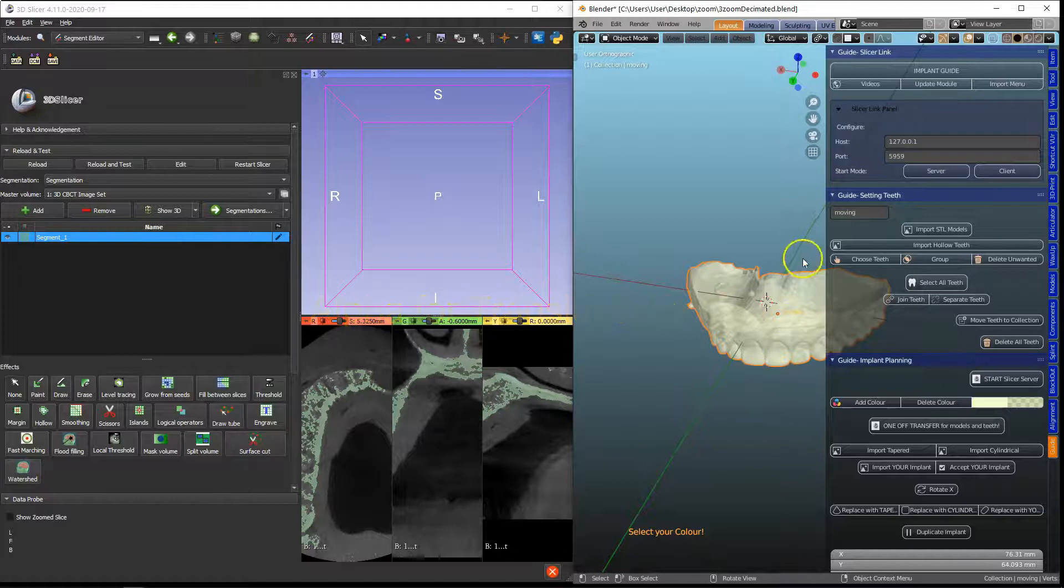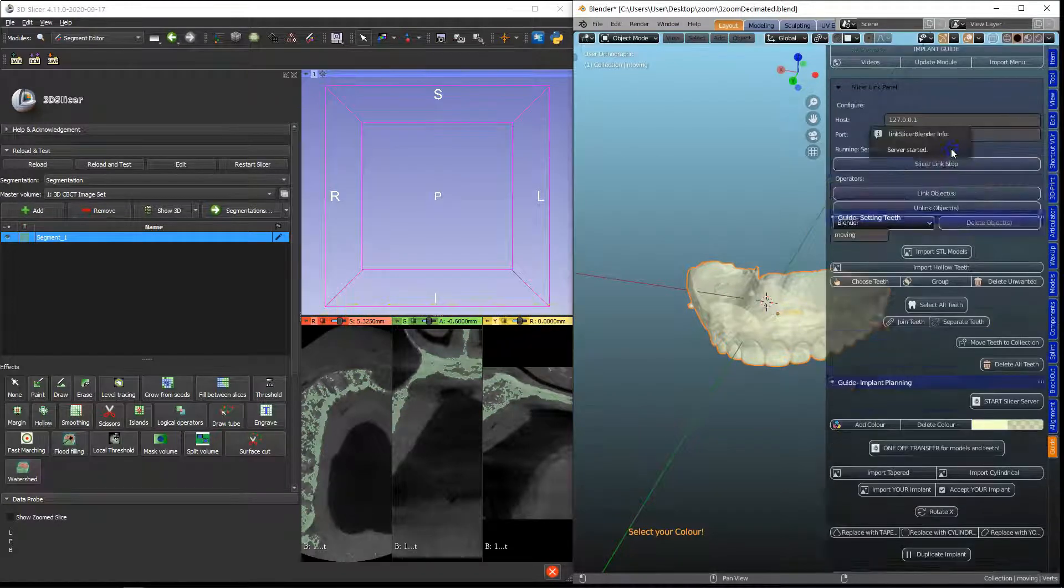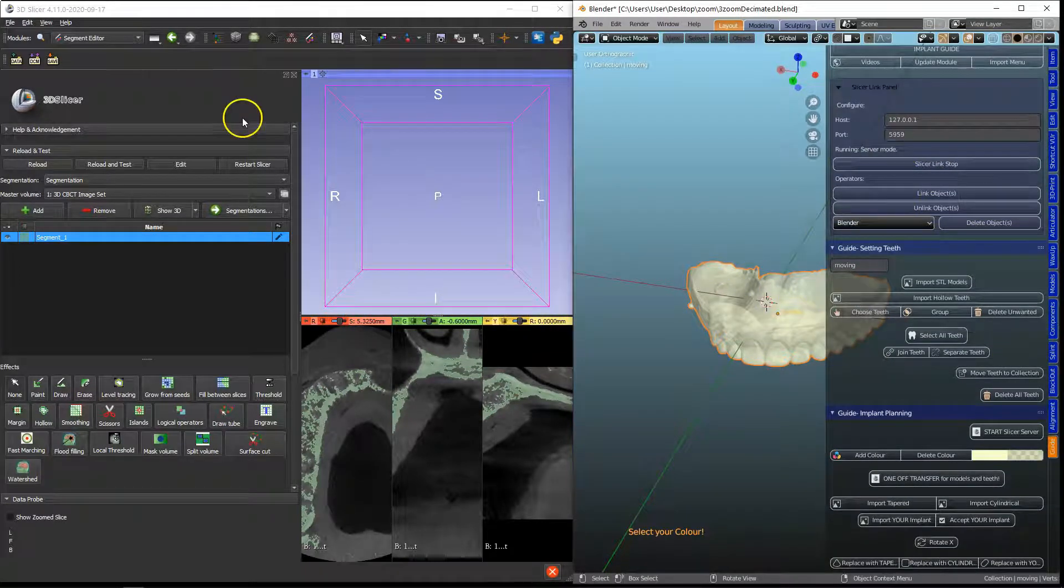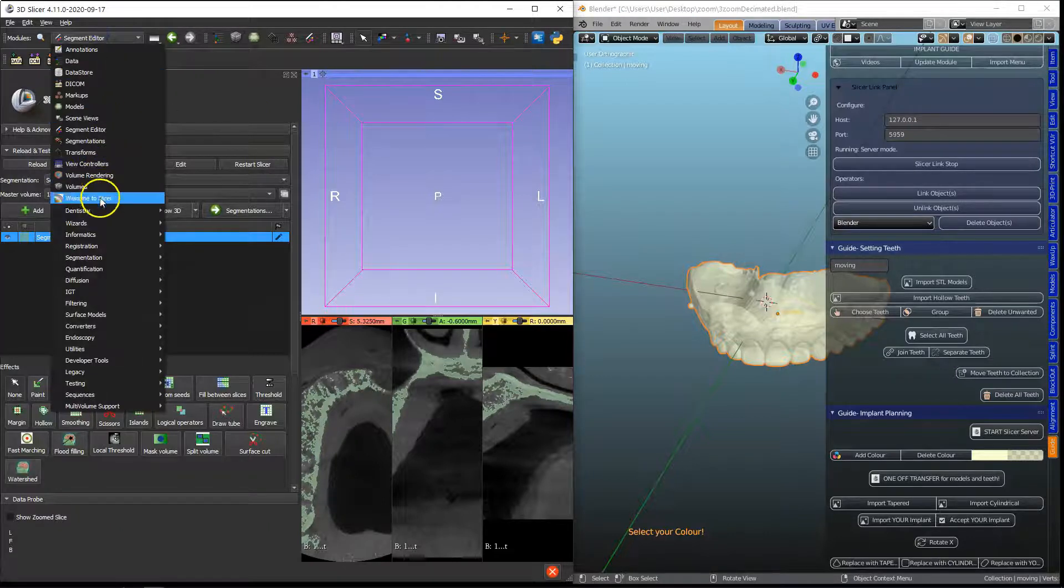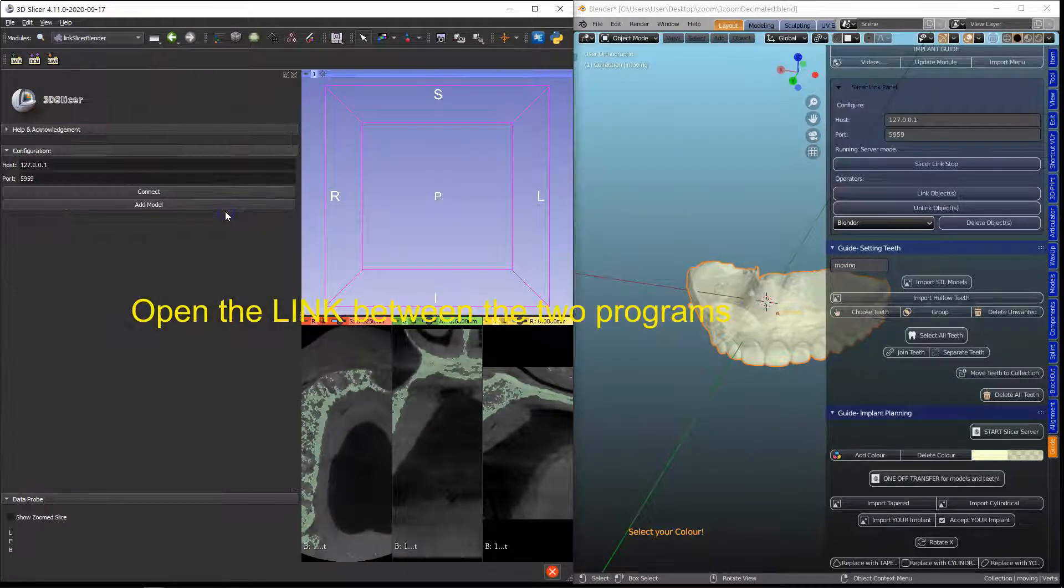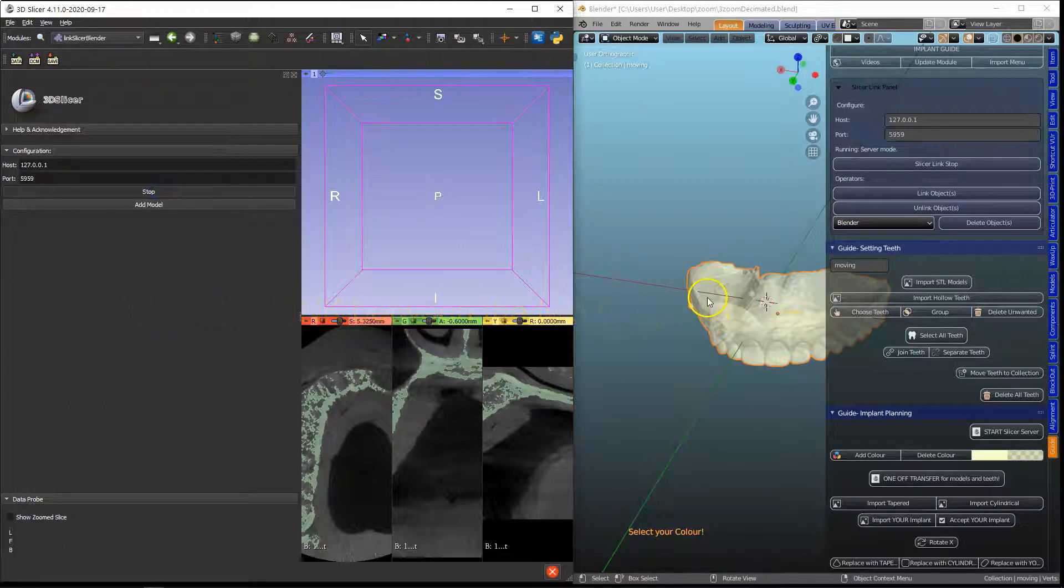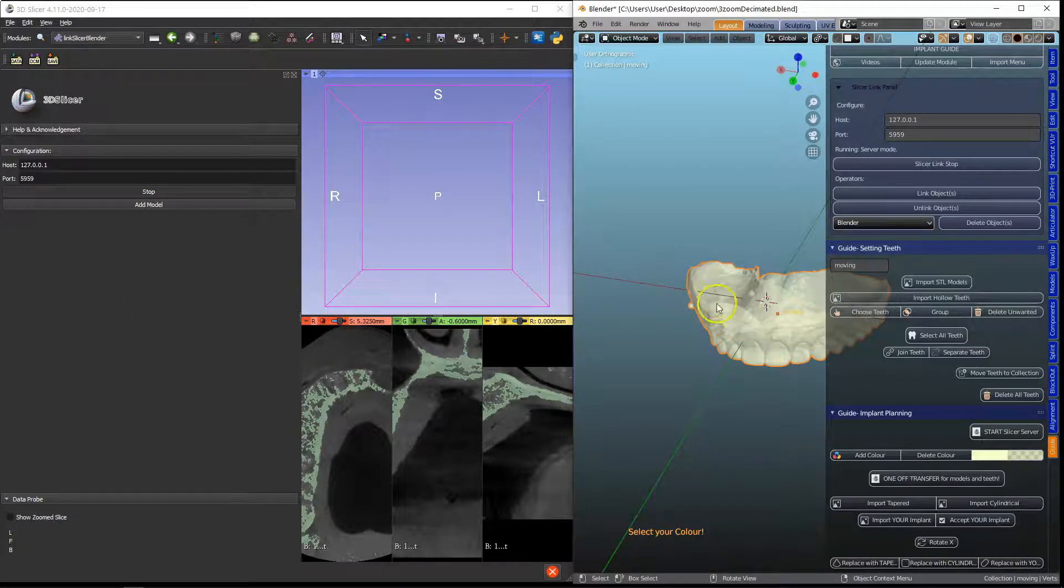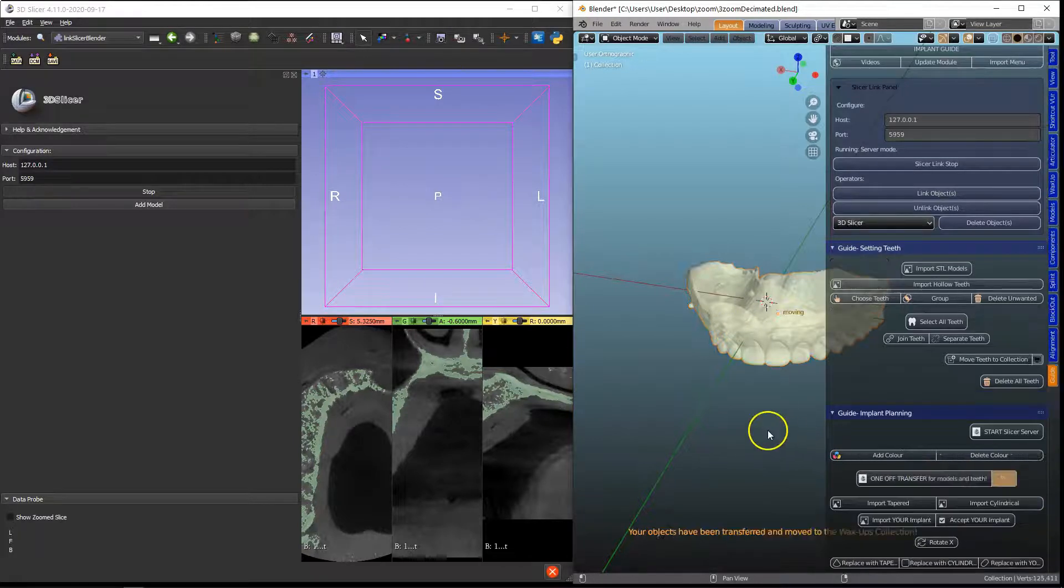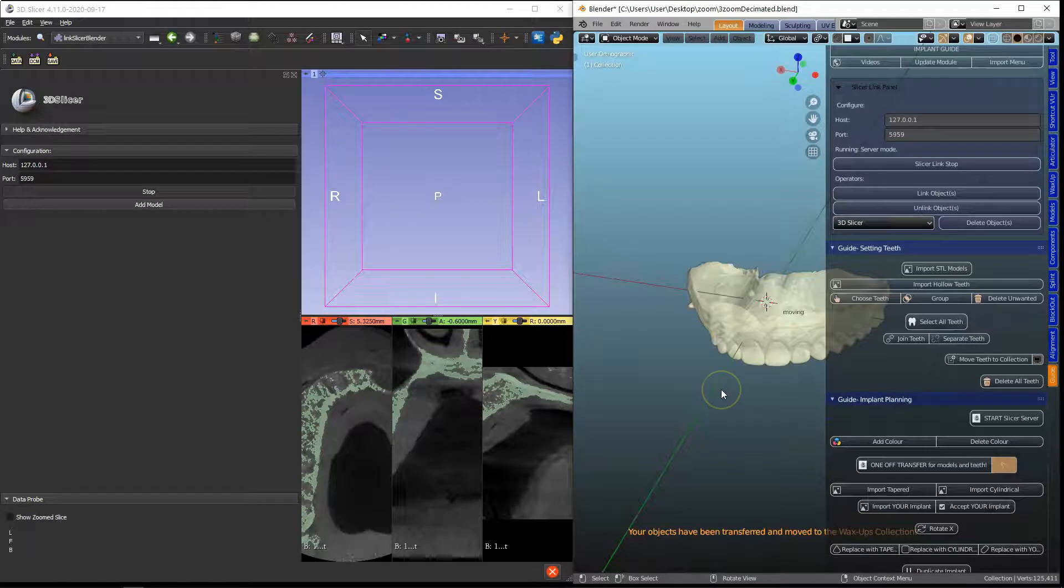Then in the guide module we're going to open up our server and in the 3D Slicer under the Dentistry tab, Link Slicer Blender, we're going to click on connect. With it being selected, left click on it, we're going to do one-off transfer and then wait for this to transfer.